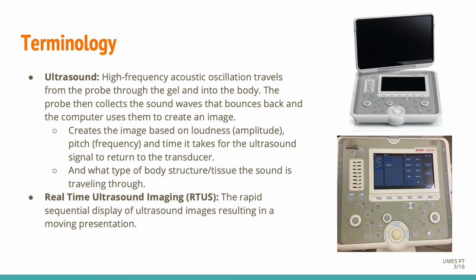Real-time ultrasound imaging, or RTUS, is the rapid sequential display of these ultrasound images, resulting in a moving presentation. So while you move the transducer, while the tissues move, you can see it on the screen.